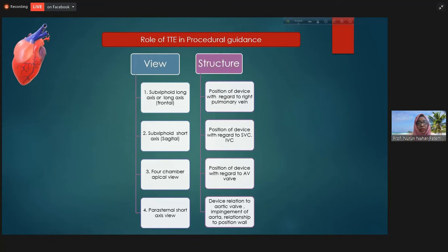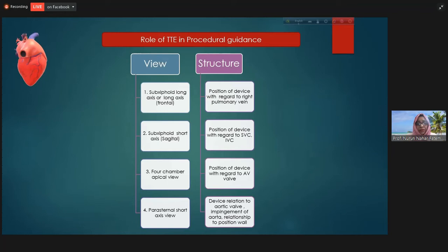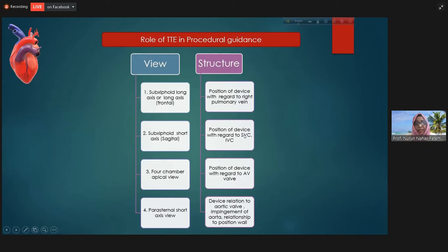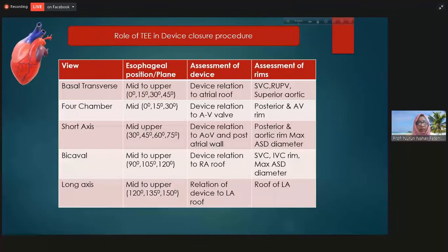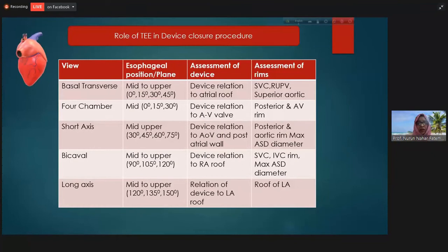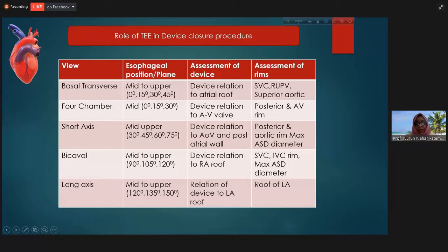For procedural guidance by transthoracic, we mainly take subcostal views, four-chamber views, and parasternal short axis views. From these views we can see the relation of the device with the roof of the right atrium, right pulmonary vein, superior and inferior vena cava, AV valves, and pulmonary vein. With transesophageal echocardiography — from basal transverse four-chamber, short axis, bicaval, and long axis views — we can see the device relationship with the atrial roof, aortic valve, atrioventricular valve, posterior wall of the atrium, and the right and left atrial roofs.